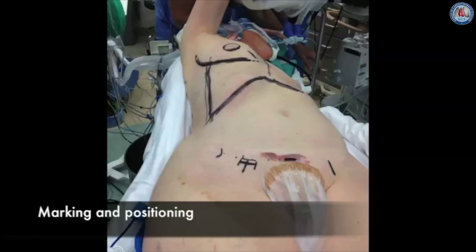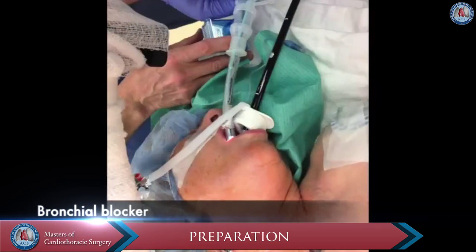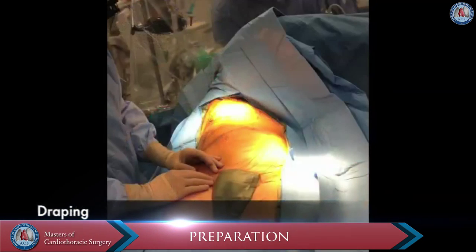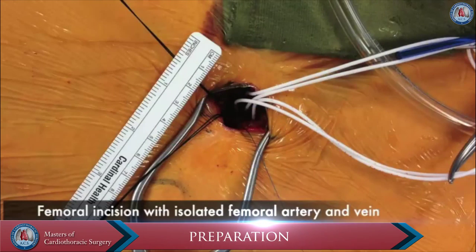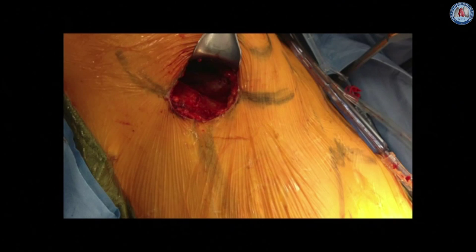The patient is positioned with the right chest elevated 45 degrees and the hips flat. A bronchial blocker is used to allow for deflation of the right lung. The patient is prepped and draped, a right subinguinal incision is made, and the femoral artery and vein are exposed.